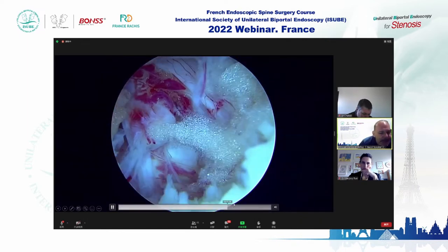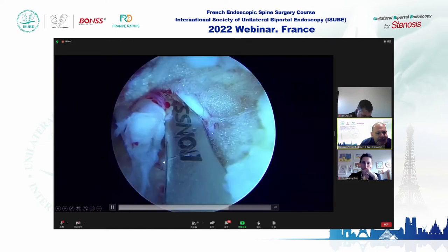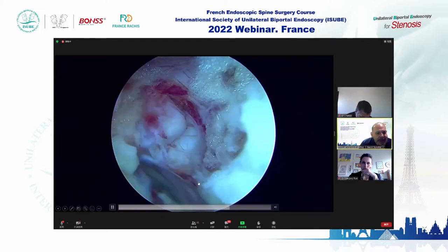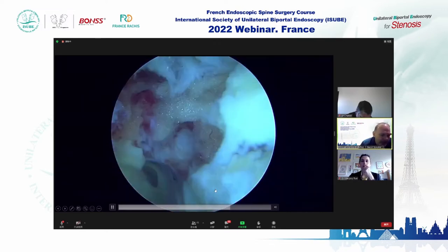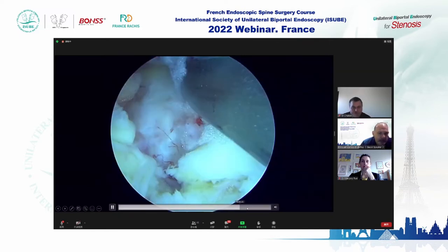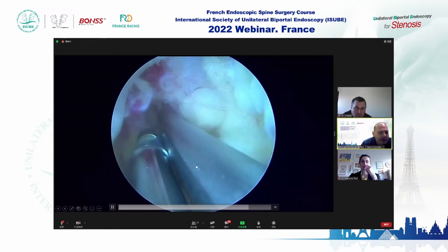Now we have the dura visible. There is some scar tissue, and we can mobilize the retractor and the nerve roots.